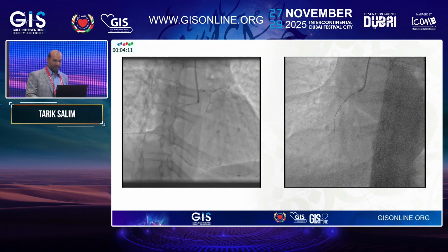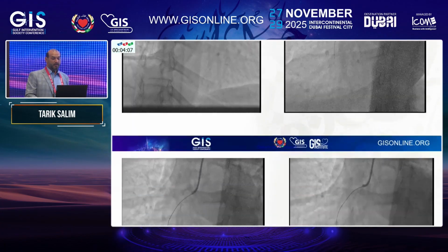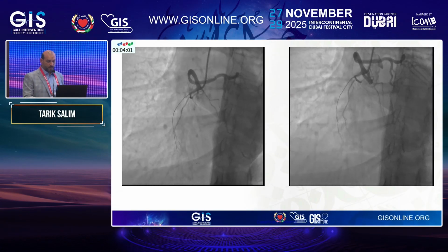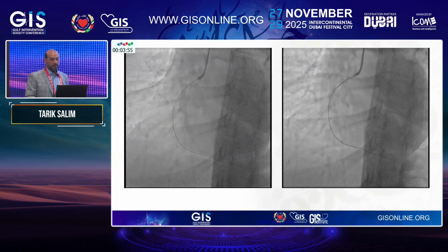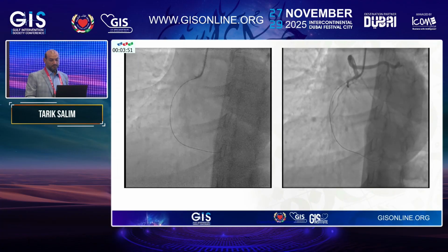Then I took a Gaia Second, and after multiple injections, I successfully punctured the cap and went into the distal segment.